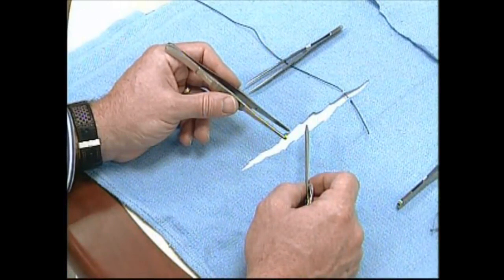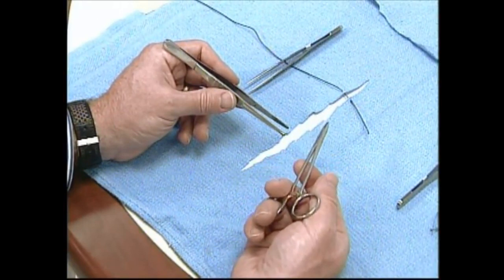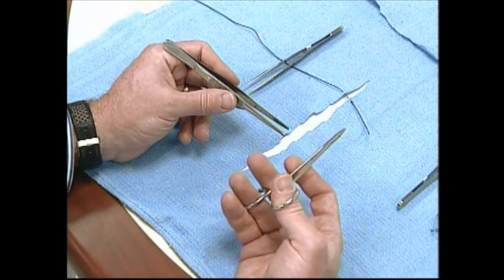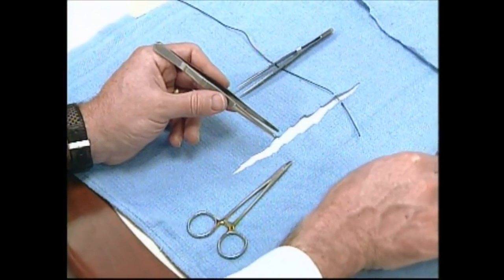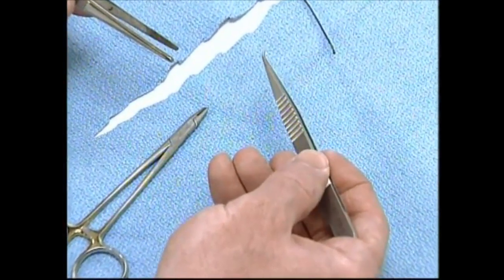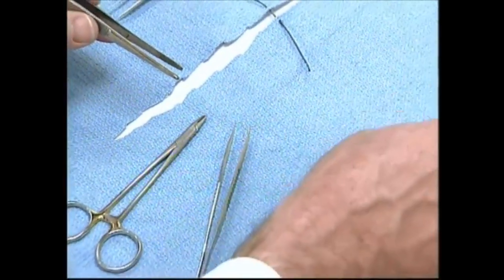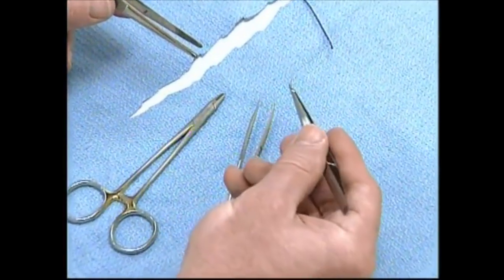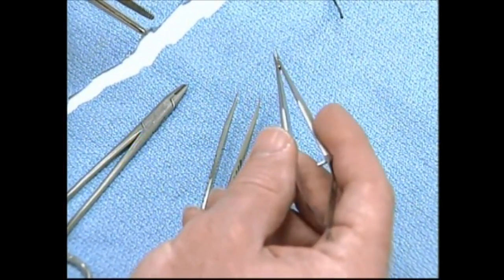What's the difference between normal suturing and microsuturing? For one, we do not use the traditional needle holder with a ratchet-type mechanism in the right hand when we do microsuturing. We typically use either a curved jeweler's forceps, which is used in many laboratories across the country to teach microsuturing techniques, or more commonly in the operating room, we will use the curved needle holder to drive the needle, since it gives a more secure purchase on the needle when driving it through atherosclerotic vessels.